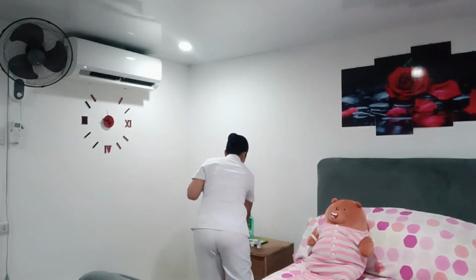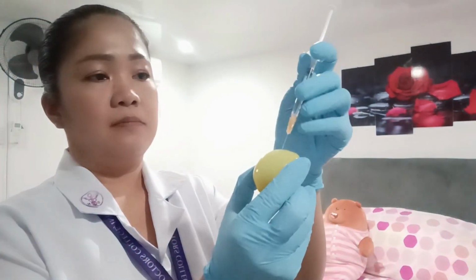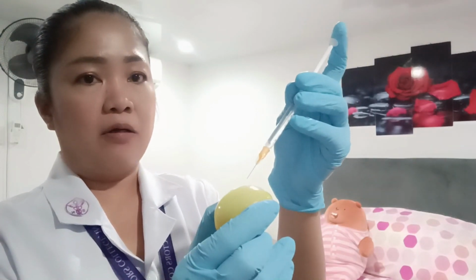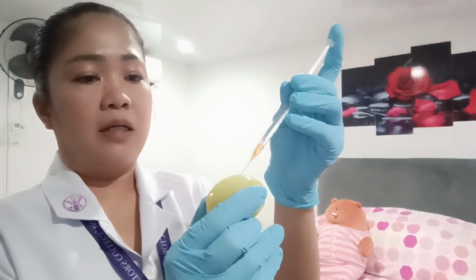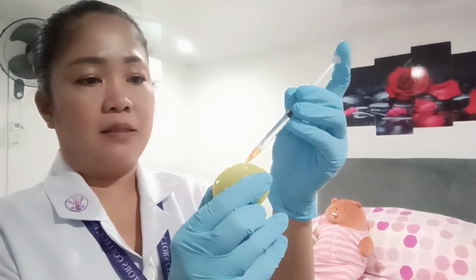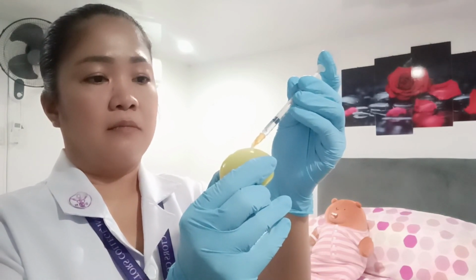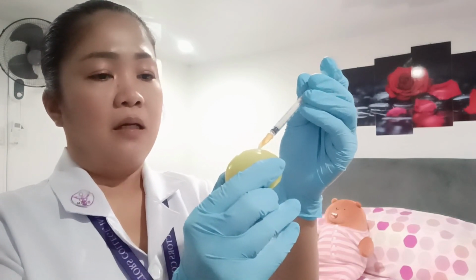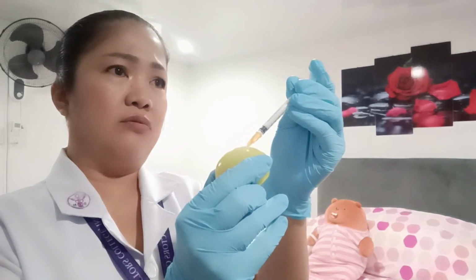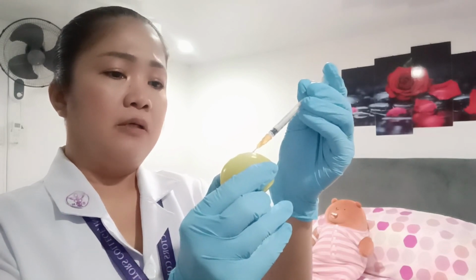The medicine. I'll show you. This is the 45-degree angle. I'm holding it like this because I am very comfortable with how I'm holding my syringe. And then insert it at 45 degrees, and release the medication slowly. And then you don't have to pull out right away. You have to wait at least 5 to 10 seconds, and then pull out really gently.